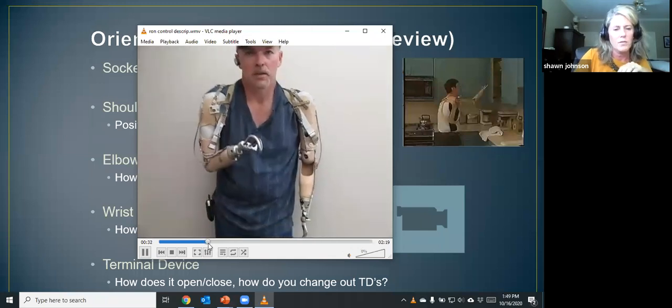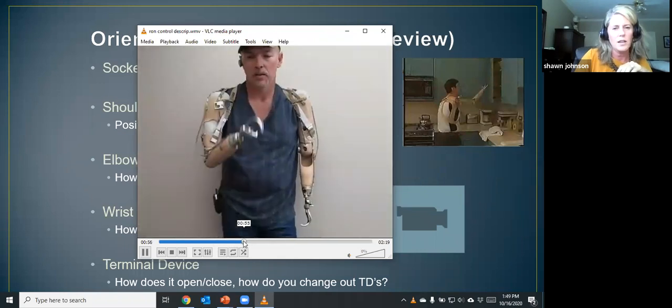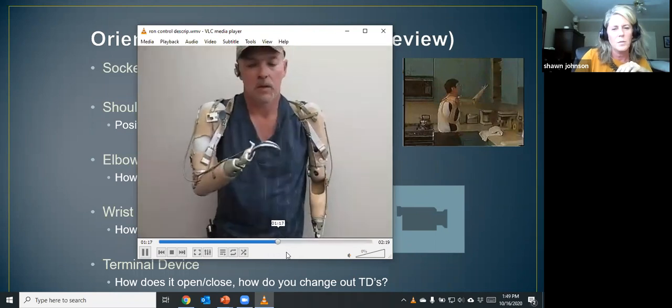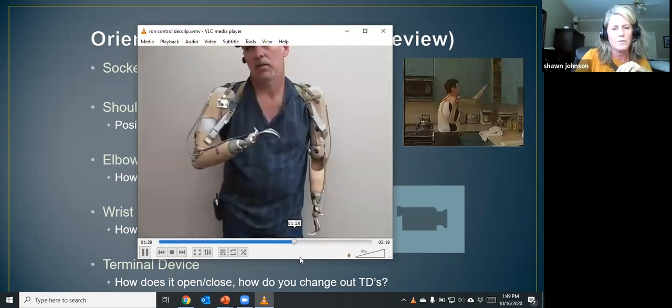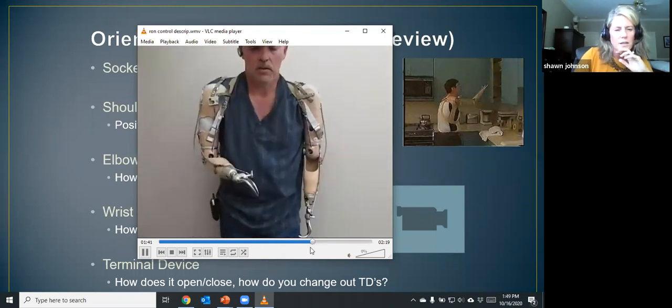I'll fast forward a second. So he's just locking and unlocking his elbow, and then opening his terminal device.